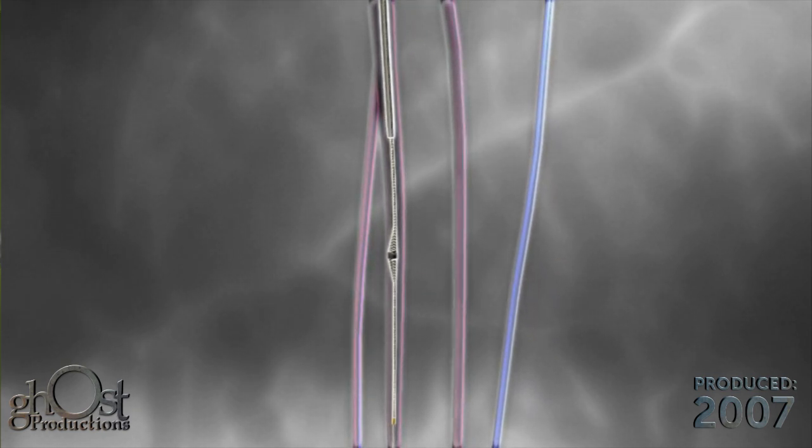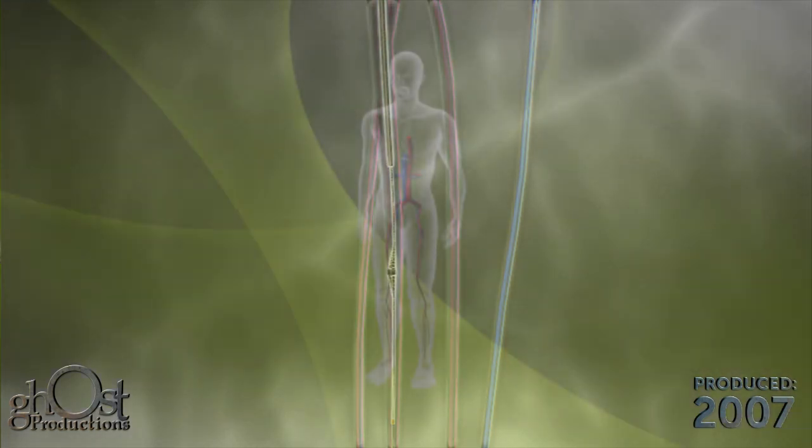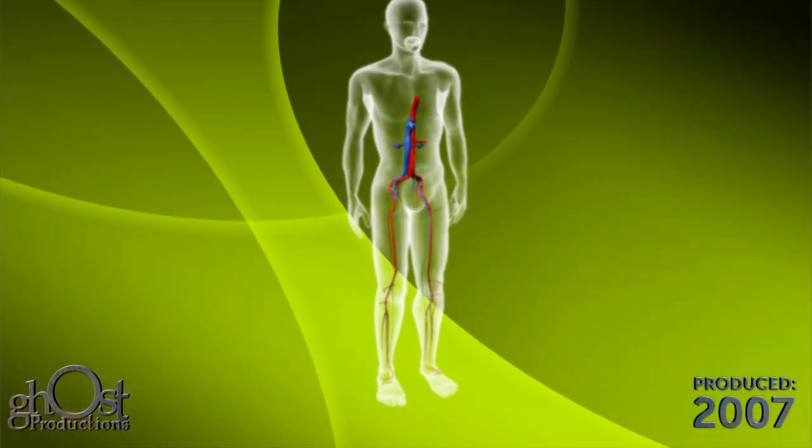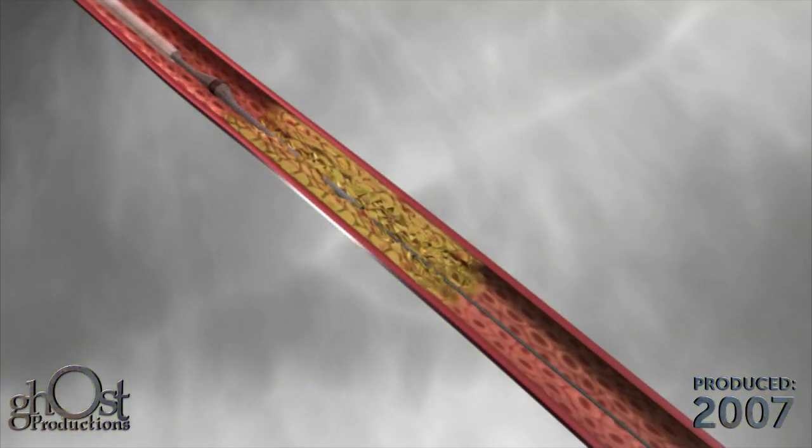The Diamondback 360 is advanced until the crown is positioned just proximal to the lesion. With the crown in this position, ensure the guide wire is at least 10 centimeters past the distal end of the lesion before activating the Diamondback 360.